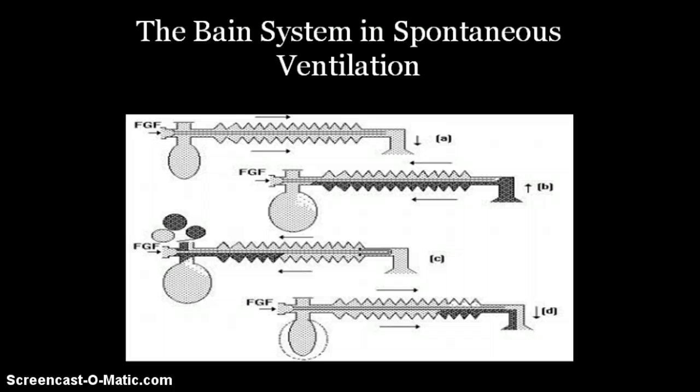During spontaneous ventilation, the breathing system should be filled with fresh gas before connecting to the patient. When the patient takes an inspiration, the fresh gas from the machine, the reservoir bag, and the corrugated tube flow to the patient. During expiration, there is a continuous fresh gas flow into the system at the patient end. The expired gas gets continuously mixed with the fresh gas as it flows back into the corrugated tube and the reservoir bag. Once the system is full, the excess gas is vented to the atmosphere through the valve situated at the end of the corrugated tube near the reservoir bag.